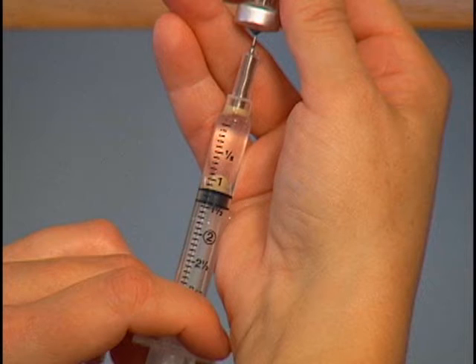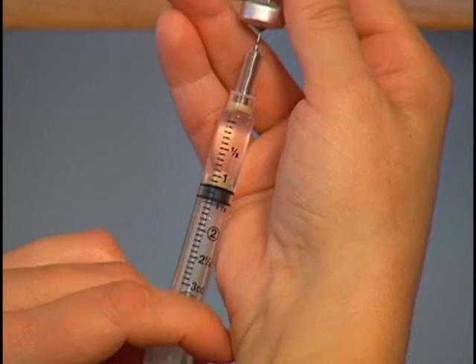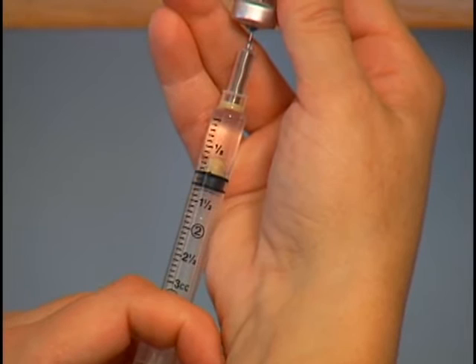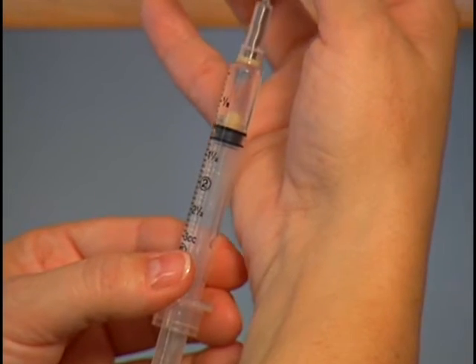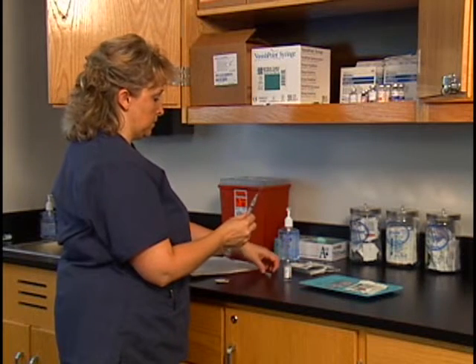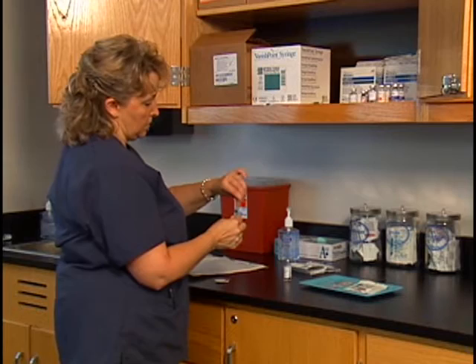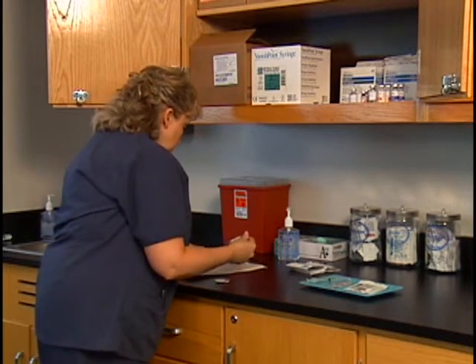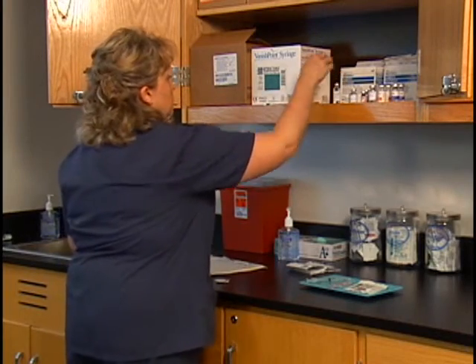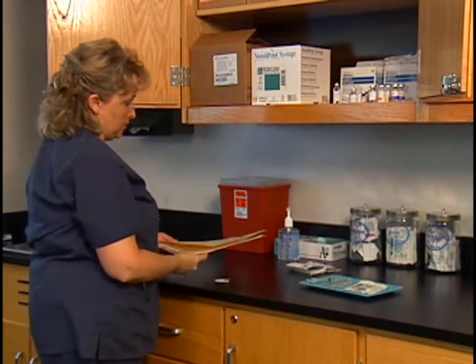Remove any air remaining at the top of the syringe by slowly pushing the plunger forward and allowing the air to flow back into the vial. Carefully remove the needle from the rubber stopper and replace the needle guard. The needle guard prevents the sterile needle from becoming contaminated. Check the drug label for the 3rd time and return the medication to its proper storage location.